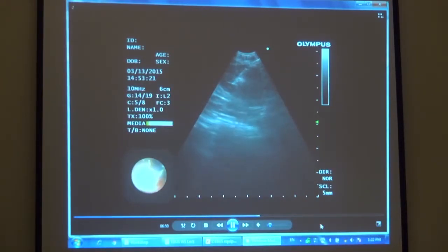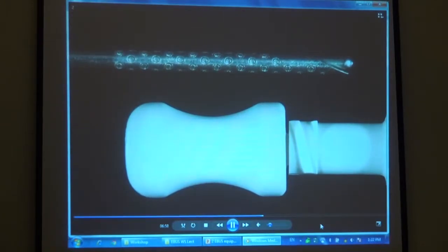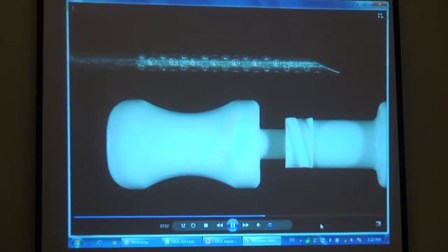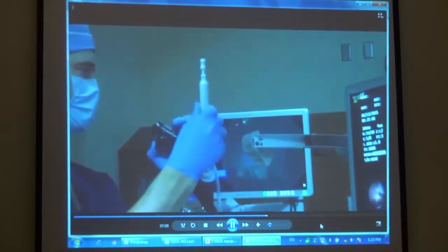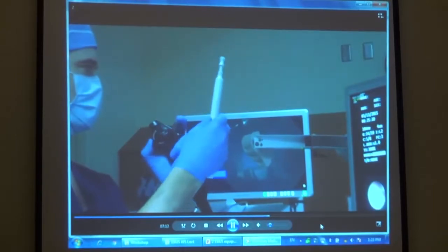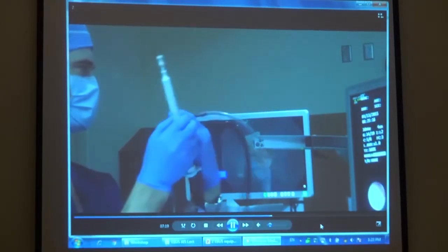There are a couple of points that are worth noting about needle deployment. First, with the stylet fully hubbed, the tip of the needle appears blunt. Therefore, retracting the stylet 1 or 2 millimeters prior to performing the puncture presents a sharper end to the needle that will help transit. Second, it is not infrequent that the needle will encounter cartilage. Advancing the needle with a quick and forceful jab often allows the needle to penetrate the tissue better than a slow and steady advance, which often just succeeds in pushing the wall of the airway further away from the transducer with the consequent loss of image.